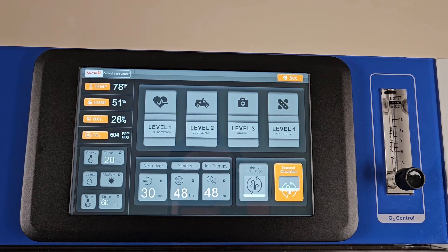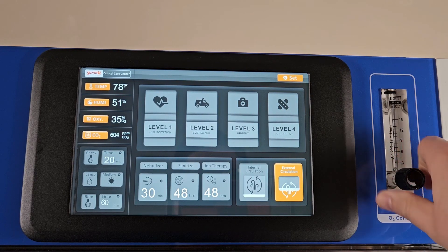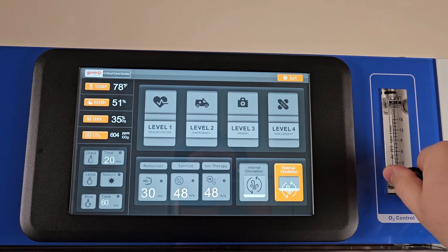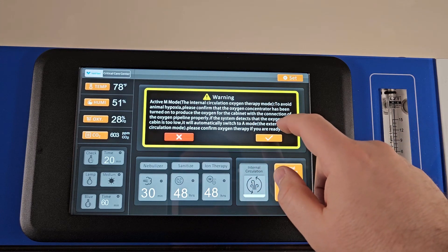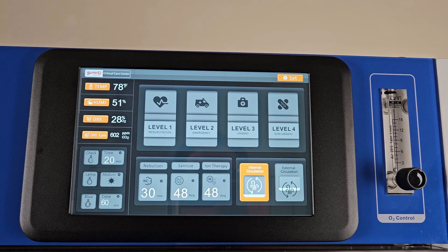To begin oxygenation, ensure the oxygen flow is open using the dial to the right of the touch screen. Set the cage to Internal Circulation, then turn on your oxygen concentrator and adjust the flow.